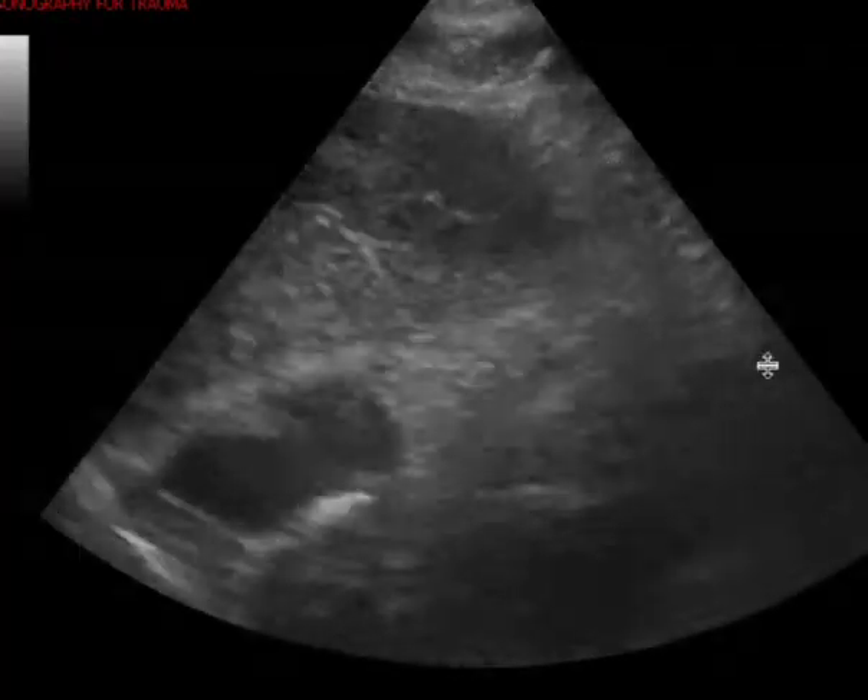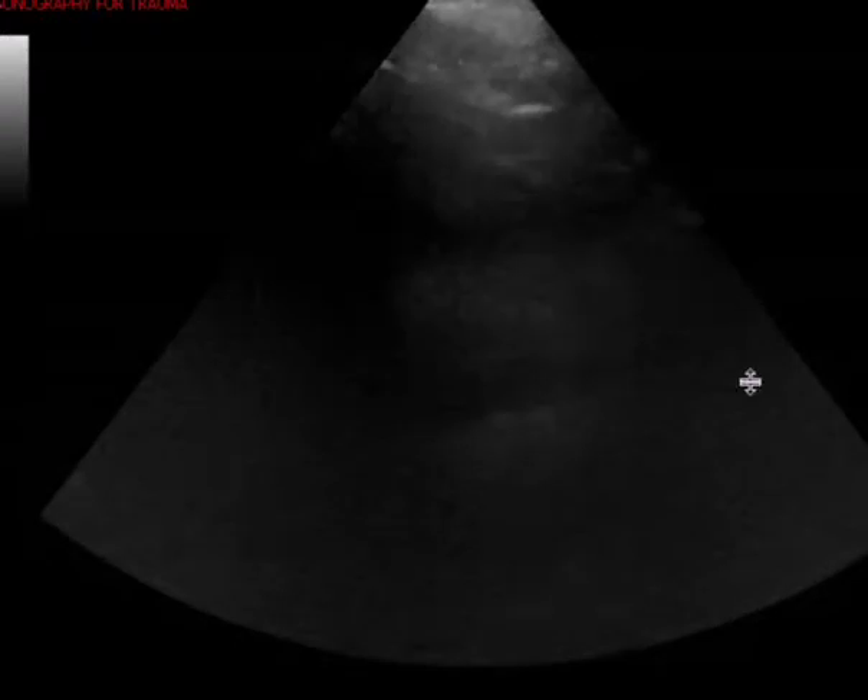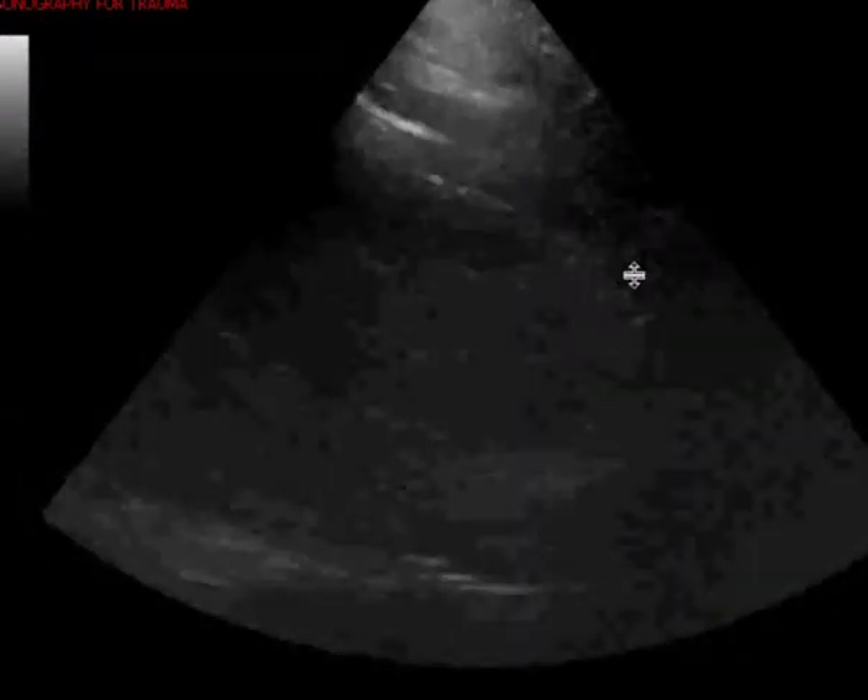I think this is the best clip you have. The second and third clips are a little challenging for me to really see if there's an effusion. I can't tell if what you're seeing here is a fat pad or an effusion, so to me it truly is a limited study.